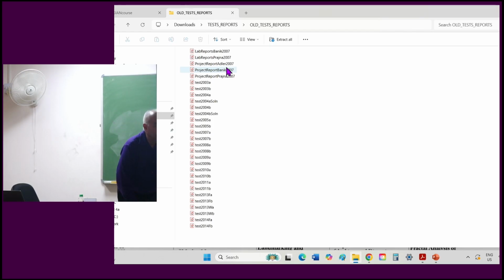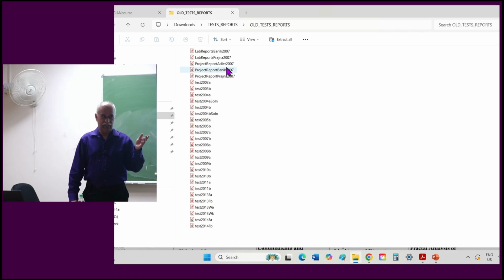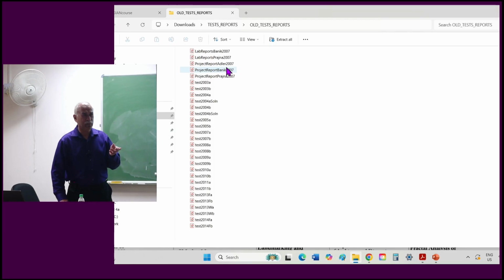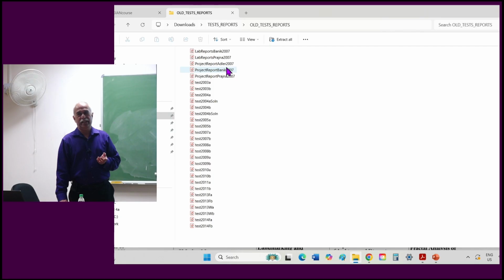On your webpage, the mammography data set was there, some zip files, downloadable. Not mammograms. I cannot give the mammograms from the screening program. There are public mammographic databases. MIAS is old. DDSM is also old. The mammograms we got from the Foothills Hospital or the screening program cannot be shared.